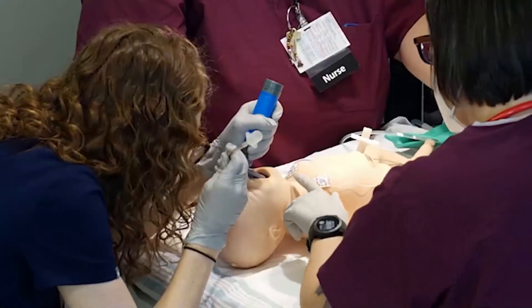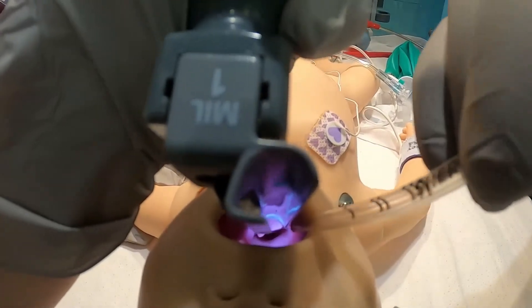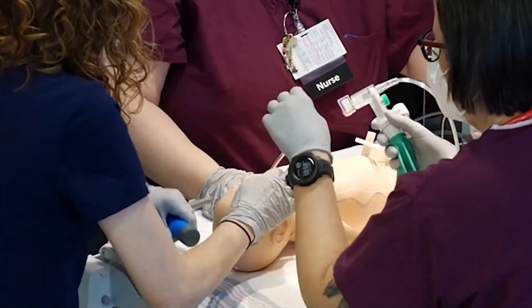Insert the ET tube on the right side of the mouth through the vocal cords. Hold the tube securely against the newborn's hard palate. I can see the tube going through the cords. Carefully remove the laryngoscope.